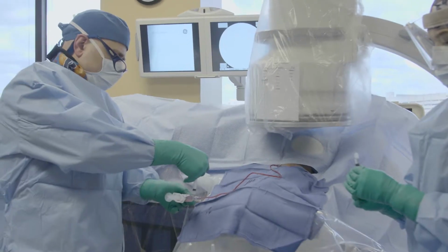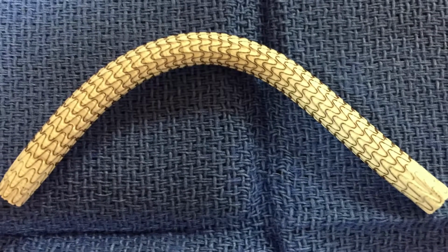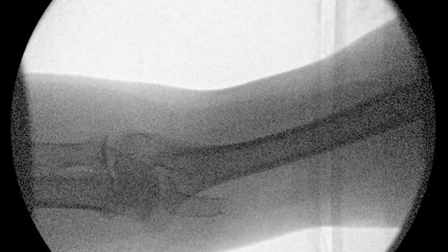Once that is done, you run dye again to see if the patient responded to that angioplasty. Sometimes they do not. In the event they do not, we have the ability to place stents. Stents are hollow tubes that go inside the vessel and dilate that narrow area and keep it open longer than angioplasty alone would, hopefully. That is not always true, but that is the intent.